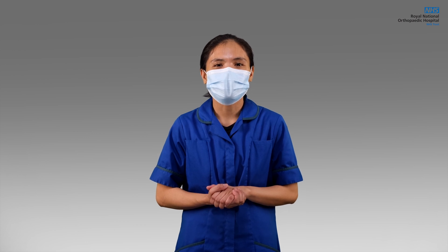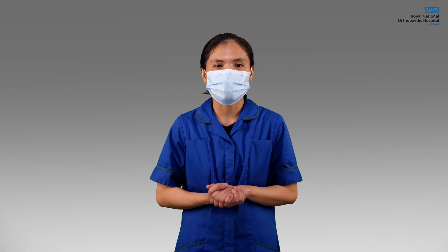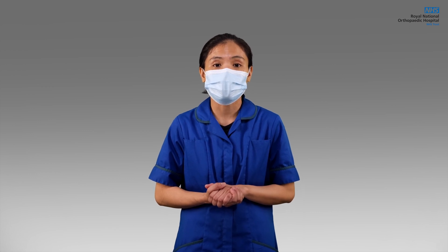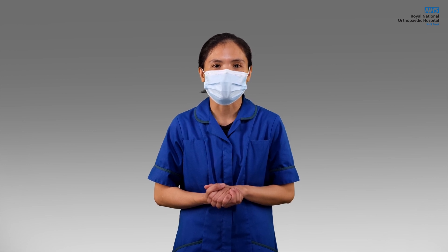To ensure correct use, always read and understand the instructions for use of the Powered Air Purifying System and the utilised components prior to use. In this video, we will show you how to correctly use and decontaminate the EasyAir Powered Air Purifying Respirator.